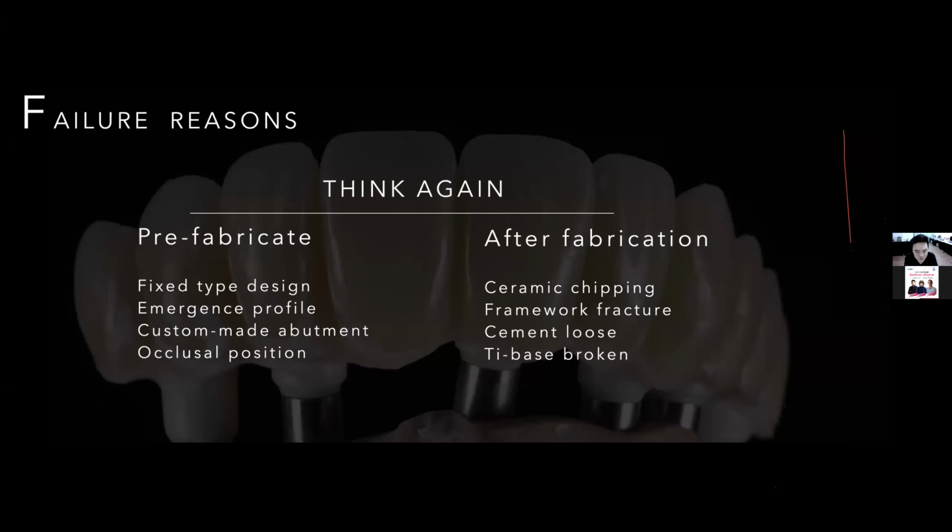But the cement loosening and the ti-base breaking are more important. Our choice is about the material quality. So please think about this, you don't need any special sense for it. Just choose the right material, make sure your material quality is good, and choose the right company and the right brand.